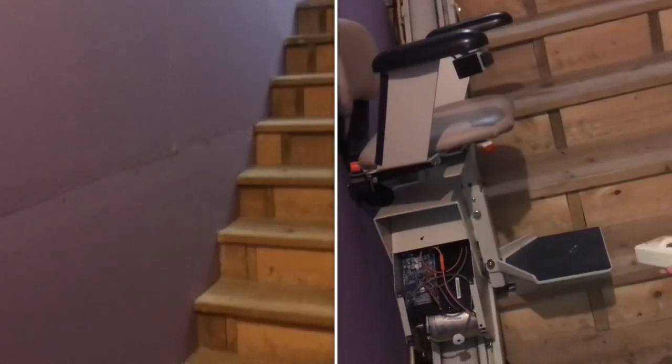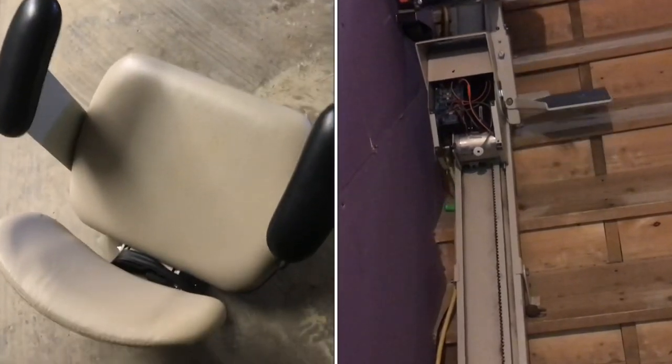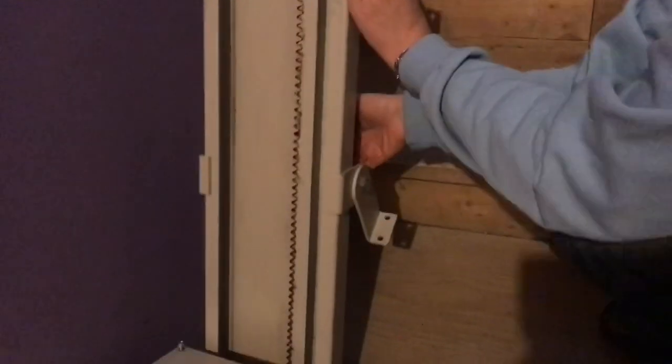We're installing a Bruno stair lift on these stairs. This is a used one, and it's heavier than it looks. The main track typically comes in two pieces. The supports can be maneuvered to fit different stair pitches. Spread the supports out evenly and just see where they naturally fall into place.